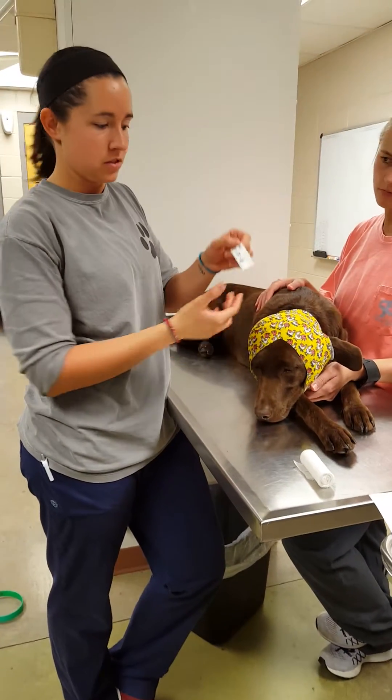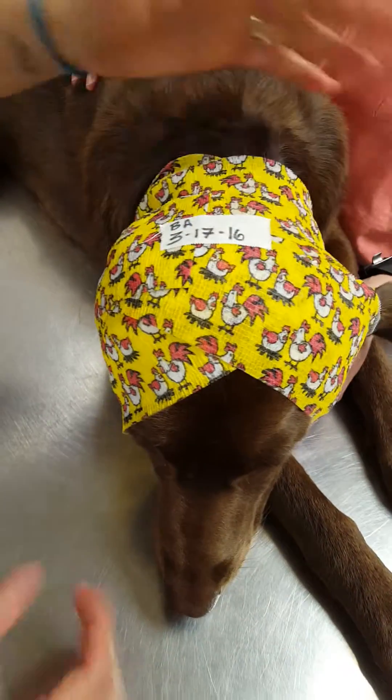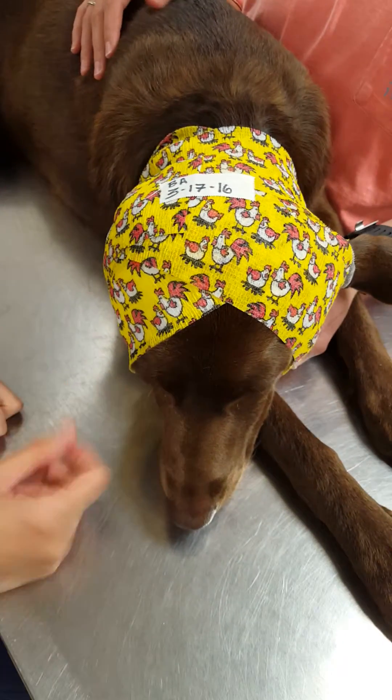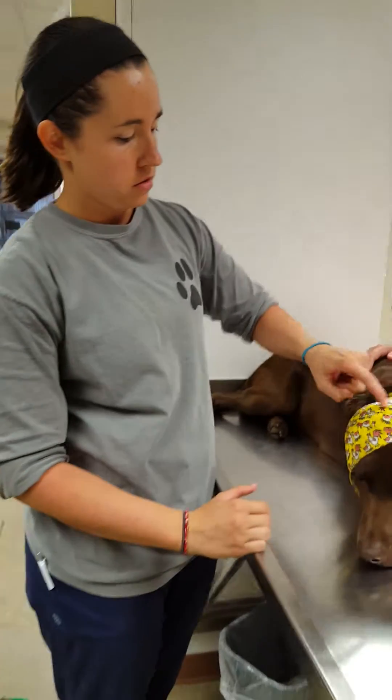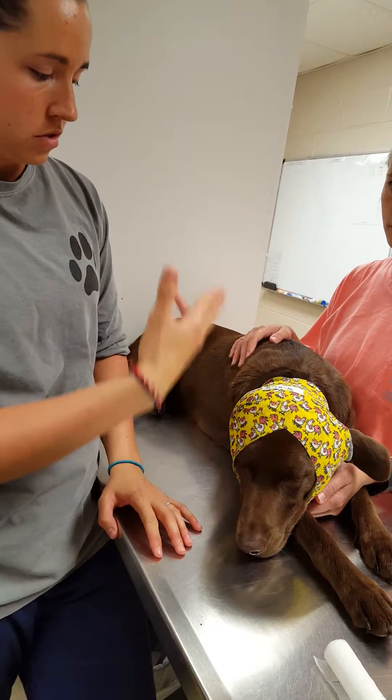The last thing I'll do is put this piece of tape right here on this tab. It's got my initials on it and the date so we know when we need to re-wrap this ear or take it off. Another thing you can do is take a sharpie and outline the ear to make sure if whoever's taking this bandage off and using scissors, they don't cut the ear.